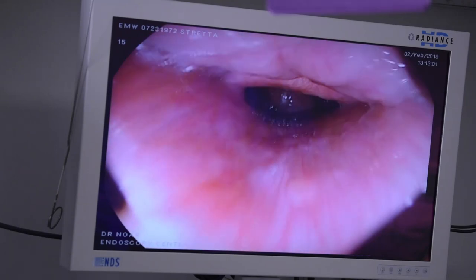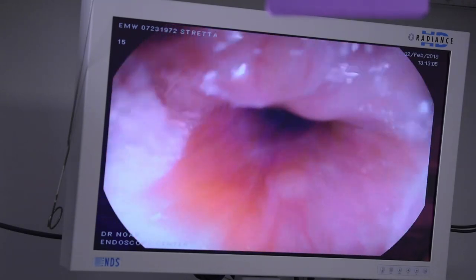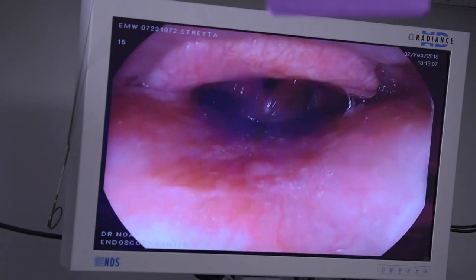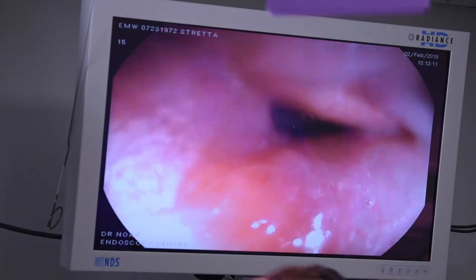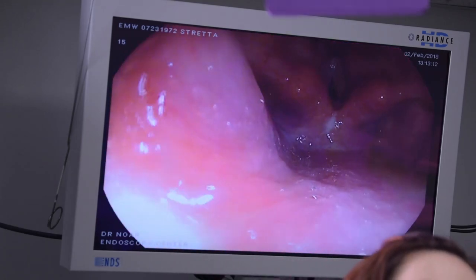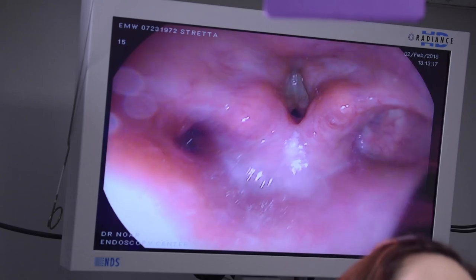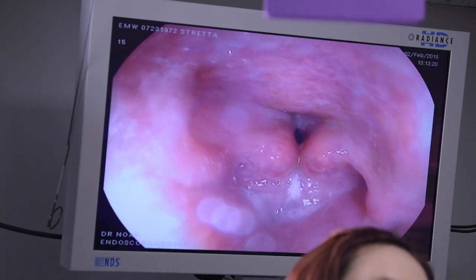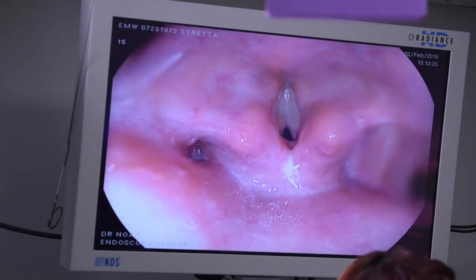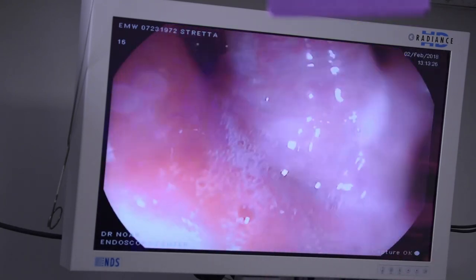You can see this cobblestone appearance to the base of the tongue — this is very characteristic of people with LPR-type reflux. This lunar-type structure is the epiglottis; we're trying to protect the airway, and we'll go under that. This is the larynx, which shows evidence of inflammation as well as inflammation at the level of the cord, so we know that he has reflux into the larynx. We'll document that with a picture to show there's no damage caused by the procedure afterwards.